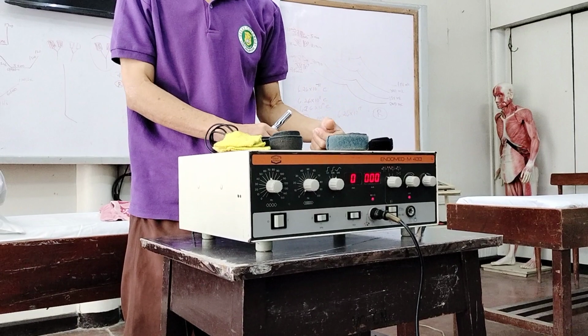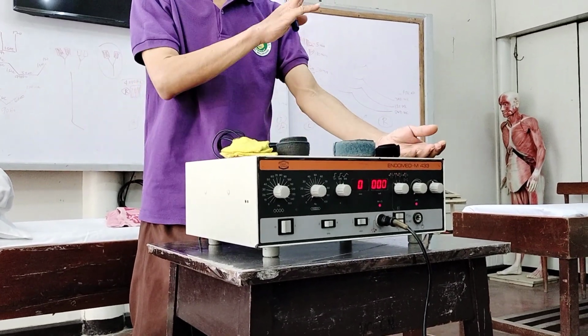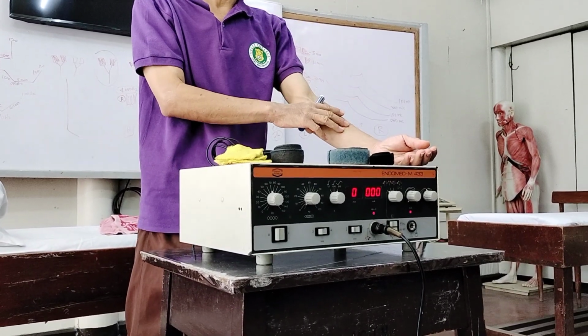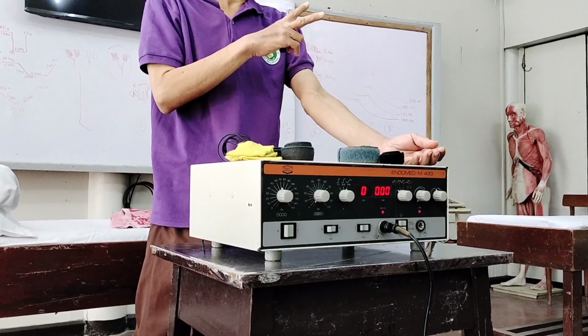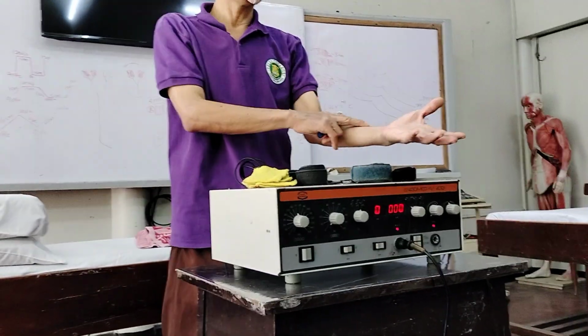But if you're stimulating 2 muscles, then the red will be placed on one muscle, and the black will be placed on the other muscle. For example, for elbow flexors, you place your red electrode, and for wrist flexors it is black.